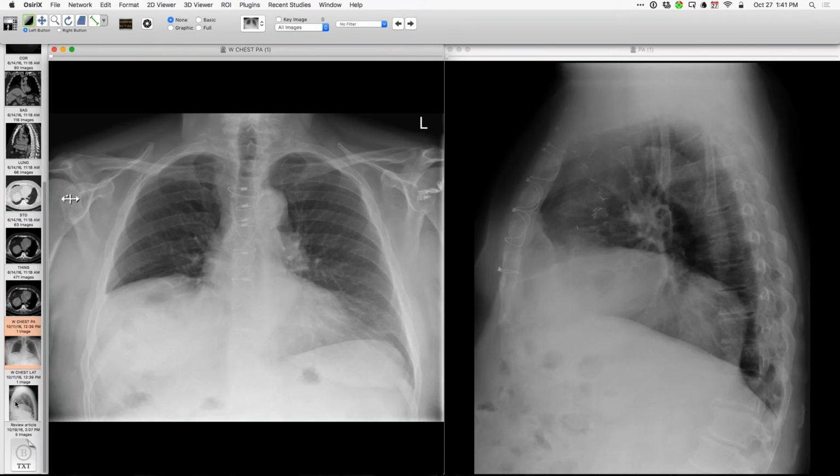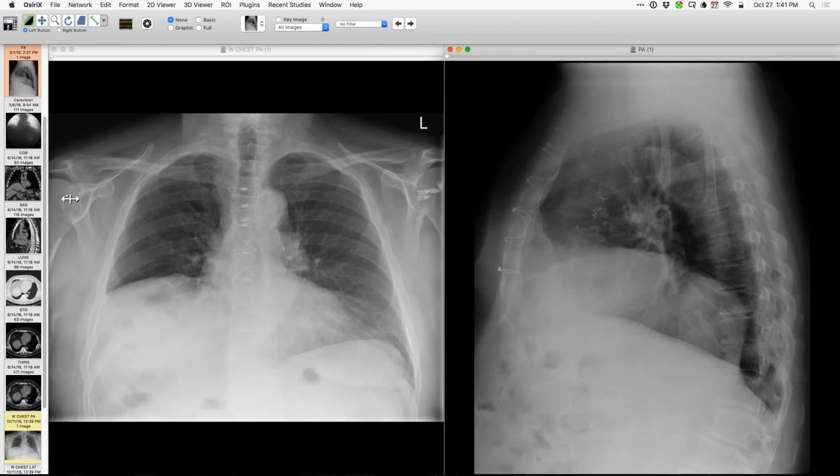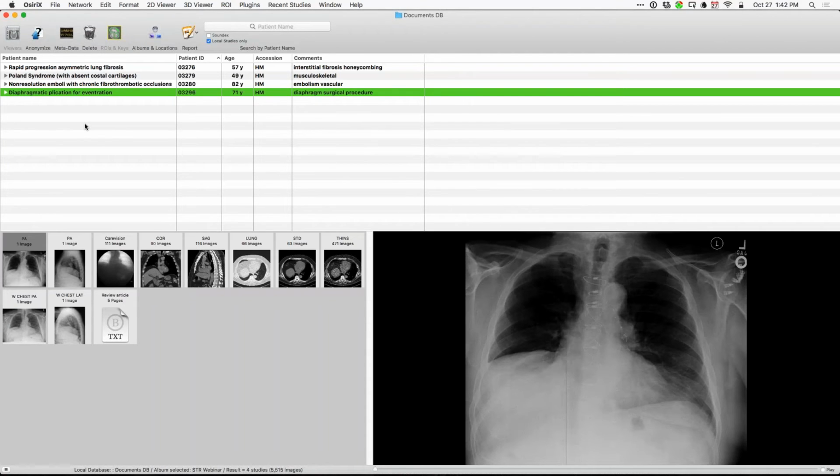If you'd done the fluoro in the lateral projection as you pointed out, you would see that you will have contraction of that abnormal hemidiaphragm posteriorly, where you showed on CT the muscle still is, but you may get paradoxical motion of the anterior part of that hemidiaphragm. So you may get this rocking motion where it moves downward posteriorly, but moves upward in the weak anterior thinned area. Yeah. Certainly that's what I would look for if I did it. It might be hard to discern, but that's what I would look for, as well. Yeah. All right. So I thought a really nice teaching case of eventration and how to think about it.